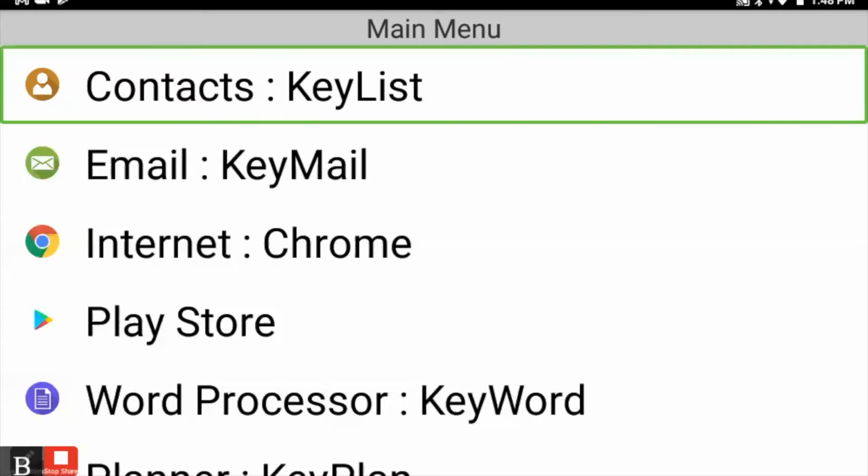So on all Humanware devices, they have what they call Humanware signature thumb keys. And so you'll find these on the front edge of your device. And depending on your device, there might be a couple extra little buttons in the center. Mine is a BrailleNote Touch Plus, so I do have 3 small buttons in the center, but these are like your home button and a back button, some other things like that, which we'll talk about a little more in depth later on. But we're going to be focusing mainly on the navigation, getting around from point A to point B at this point.